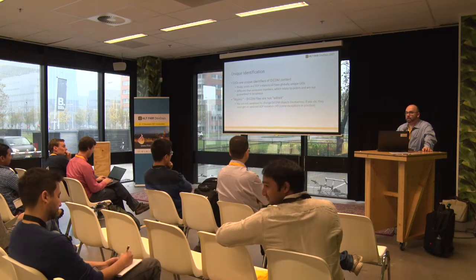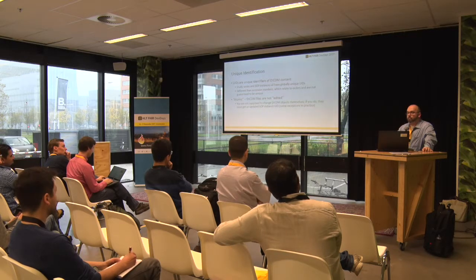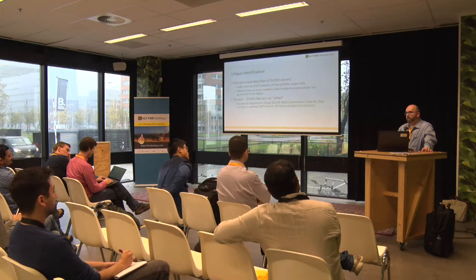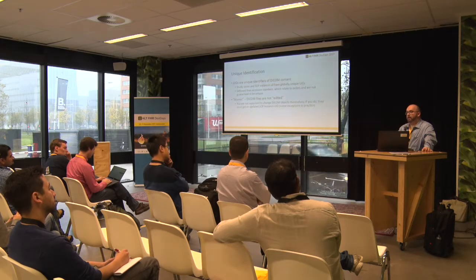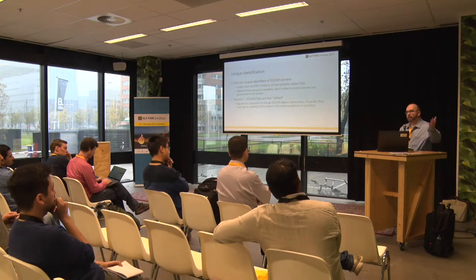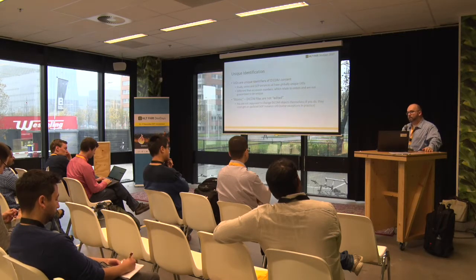You mentioned somewhere image storage in EHR and EMR, but I usually see in the usual workflows that these DICOM images are stored in vendor-neutral archives. So are there scenarios, medical workflows, where it is stored in these EMR or EHR databases? What we tend to see, and we'll cover a little bit more of this tomorrow, is a PACS would send a message to an EMR to say there's an existence of a study, and we'll provide the study instance UID or the accession number, and typically what happens is the EMR will call the PACS vendor's image viewer, usually a zero footprint web viewer, to visualize that inside the EMR.